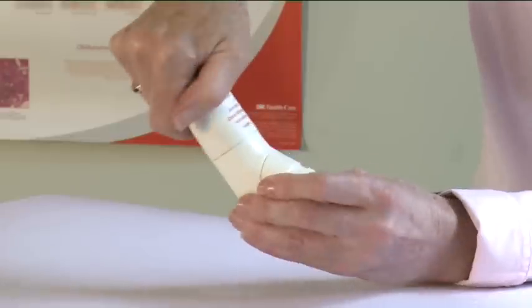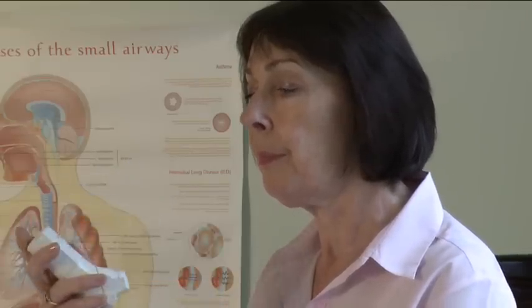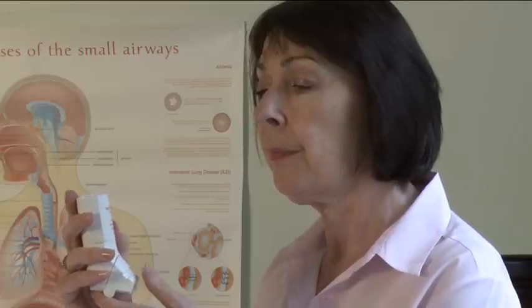To use your Easy Breathe Inhaler, shake the inhaler vigorously. Hold the inhaler upright and open it by folding down the cap which fits over the mouthpiece.